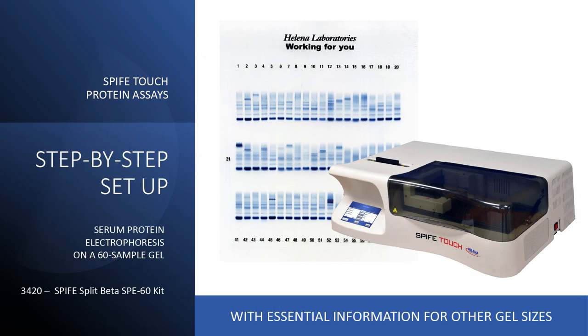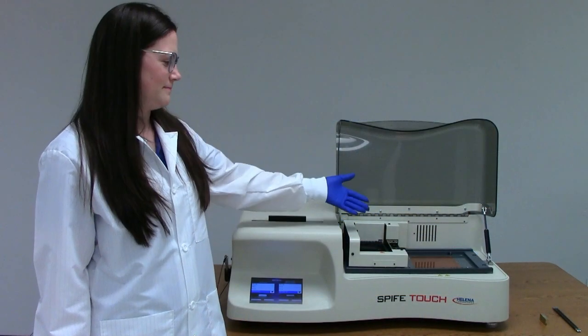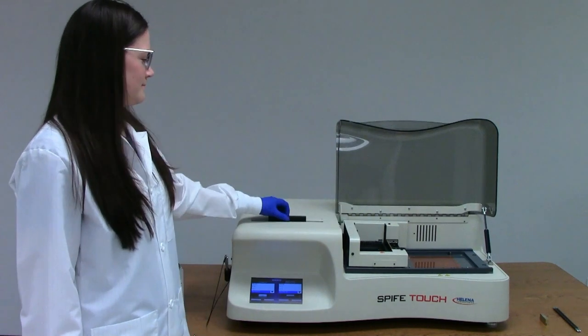Now let's advance to the comprehensive step-by-step segment of the video, beginning with the SPIFE Touch setup for serum protein electrophoresis. While this video focuses on a 60-sample protein electrophoresis gel, we will also provide essential information for configuring other assay options. The SPIFE Touch consists of two distinct units, the separation unit on the right side and the stainer unit on the left side.